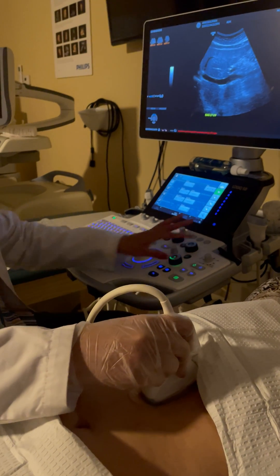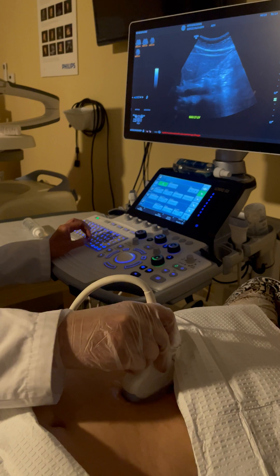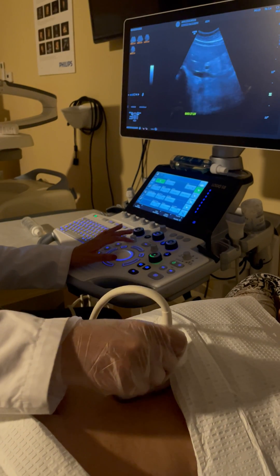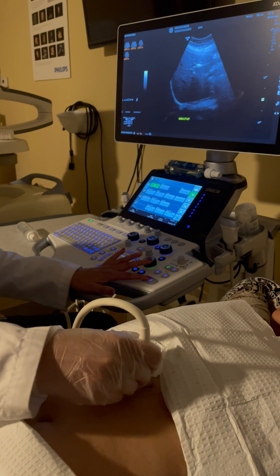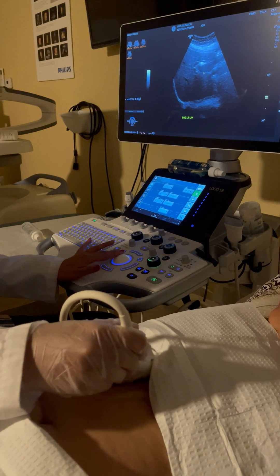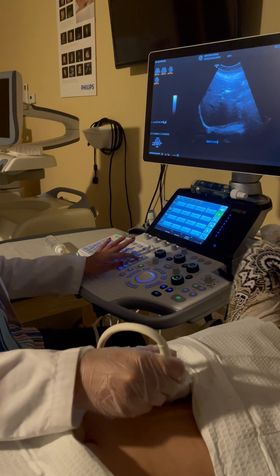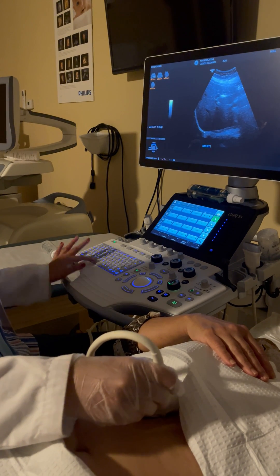For the next image I decrease depth slightly and take the main lobe fissure, making sure to include the diaphragm and show the neck of the gallbladder. The main lobe fissure appears as a hyperechoic line, and it connects the portal vein with the neck of the gallbladder — the diaphragm should be seen completely. The main lobe fissure is what separates the left lobe from the right lobe.